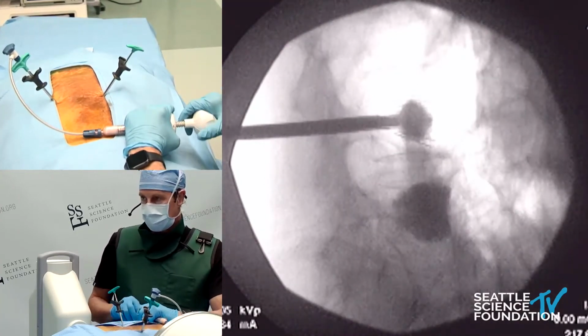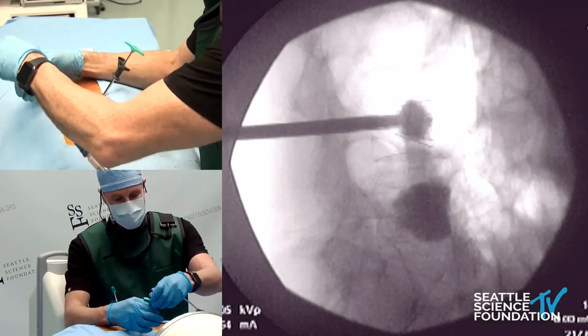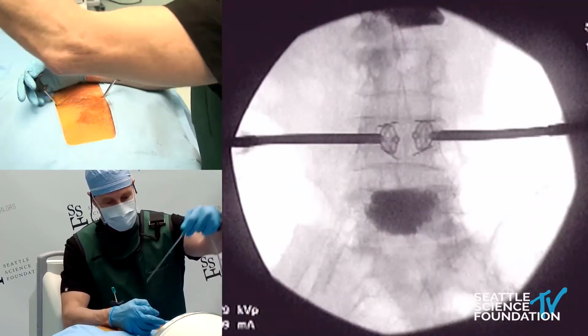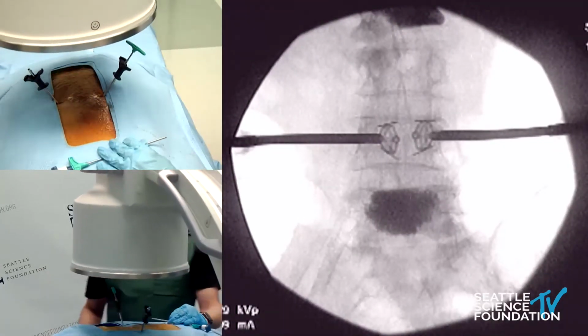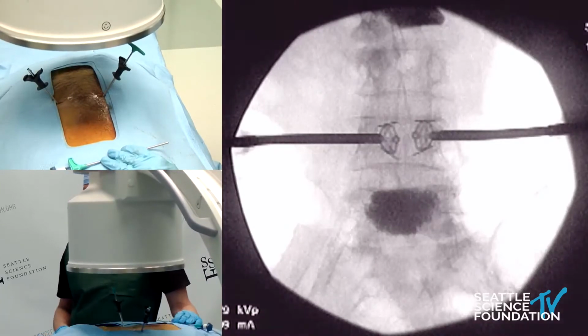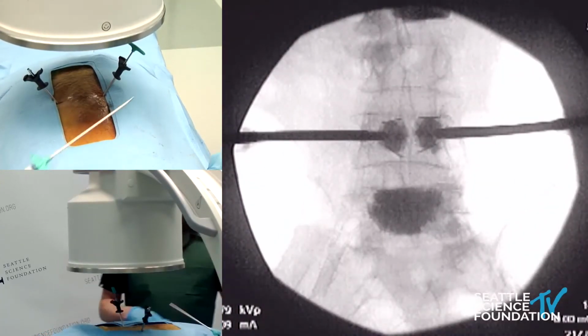Very nice fill. And at this point in time, let's take an AP shot, see how we're doing. The working channel has a little pore, a hole in the anterior portion. So that's what's coming out. Very nice. A little bit more.